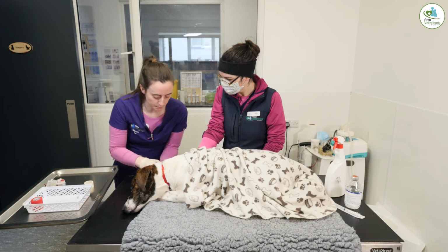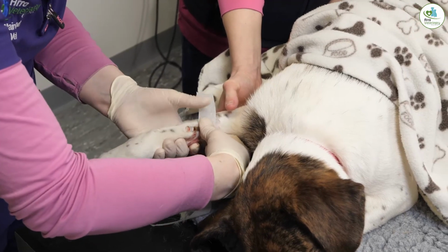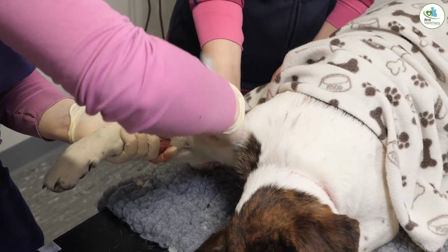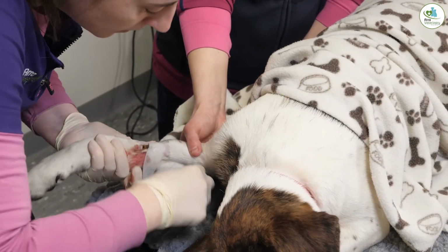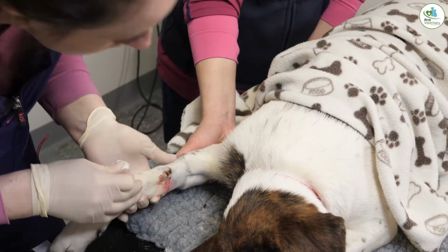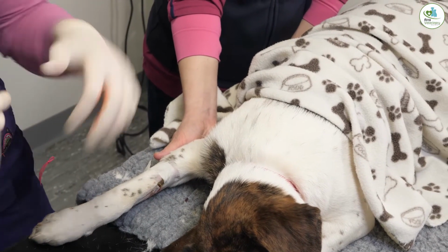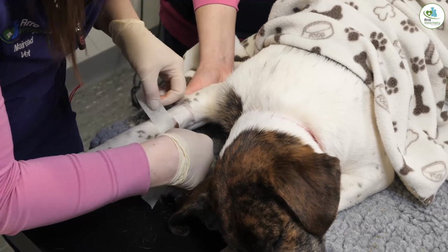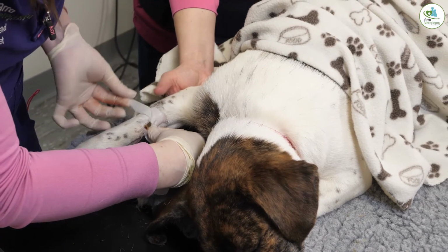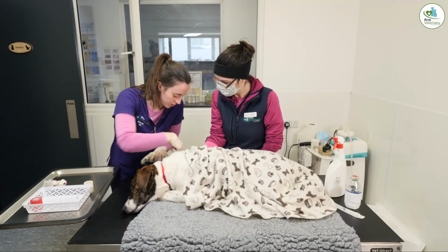Now we put the tape on. So I do one on top to hold it in place, like that. Just give it a clean again. And then your other one underneath. So where that little cut is on it, you can slide that up around it to hold it a bit more securely up like that. And then around the back again, so that you have it nicely secured.